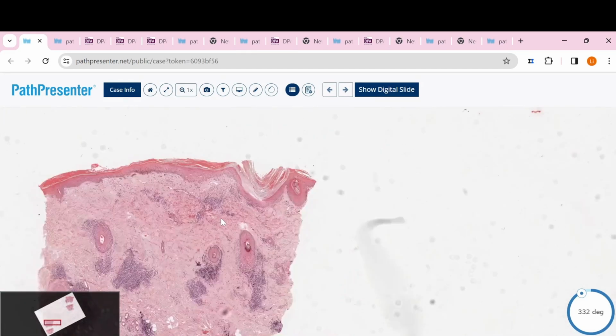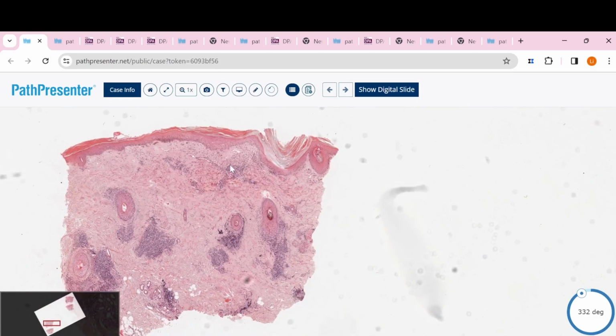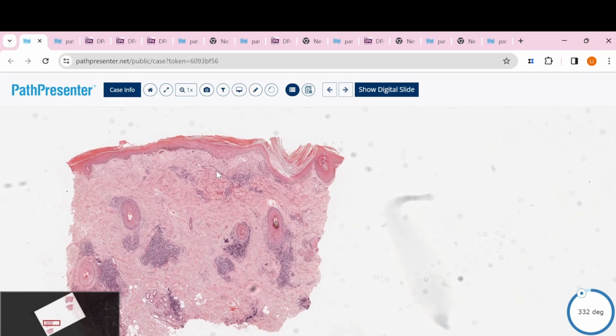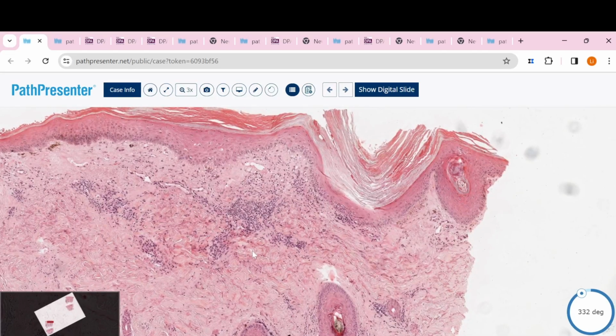So just a really quick recap: follicular plugging, superficial and deep lymphocytic infiltrates, perivascular, perifollicular, peri-eccrine gland. Then in high power, you can see this vacuolar interface change. This is lupus. Usually, you also want to see some mucin deposition, but usually it is really difficult to see. But if you see some bluish acellular material deposition, that is also really good for lupus.